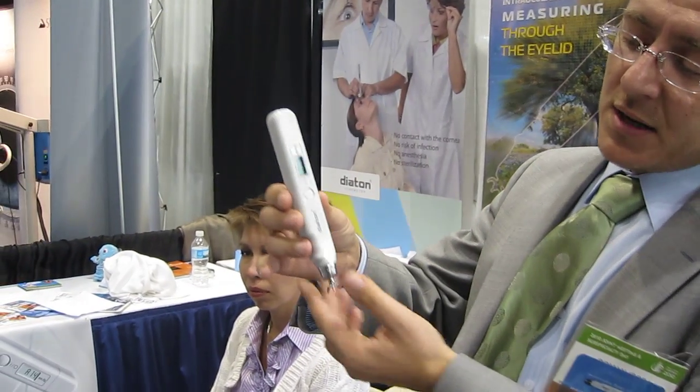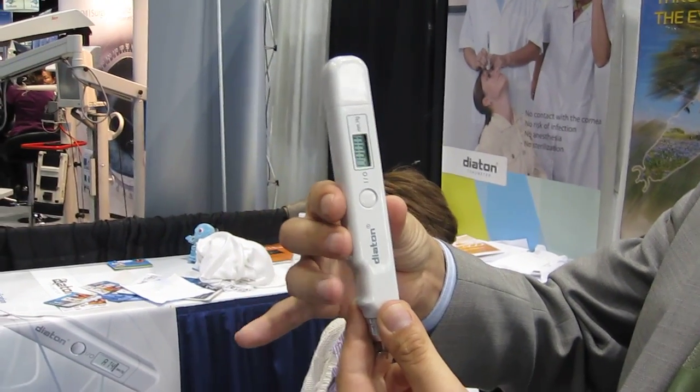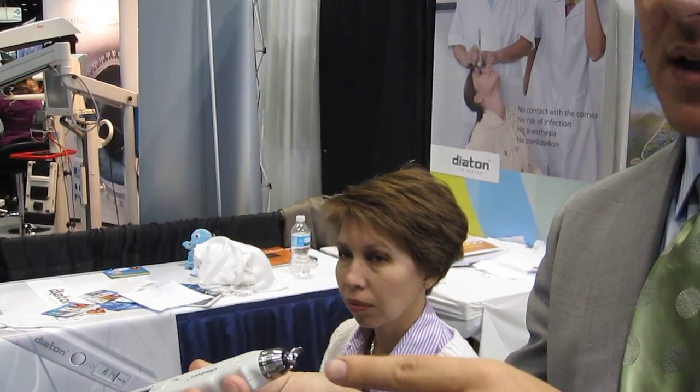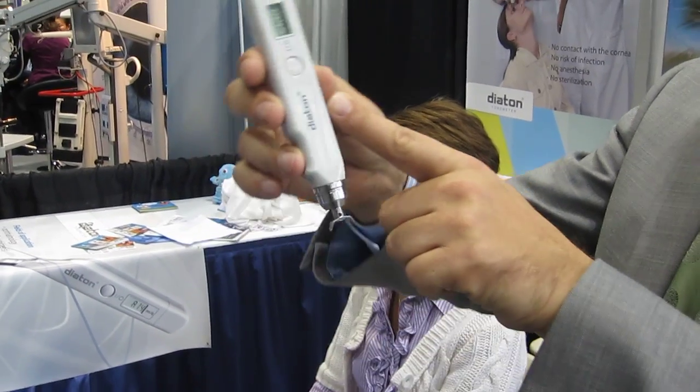The tonometer is operated with a single button which goes on and off, and has a little floater on the bottom. The way you would hold the device is three fingers on one side and a thumb on the other, like a flute. To operate it, simply tilt back so this middle floater falls inside the body of the tonometer, then come back to the initial position.